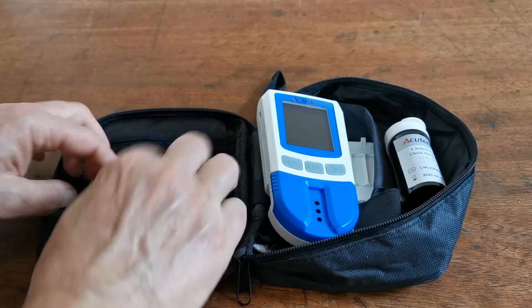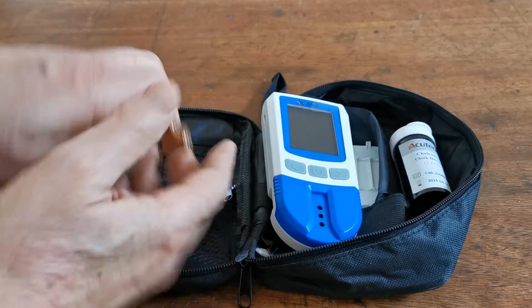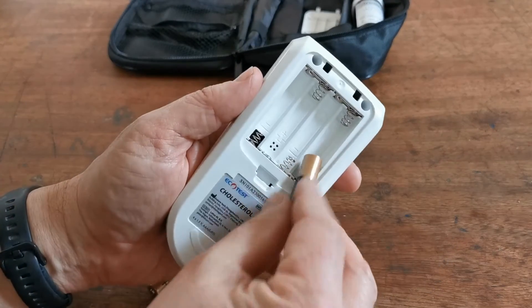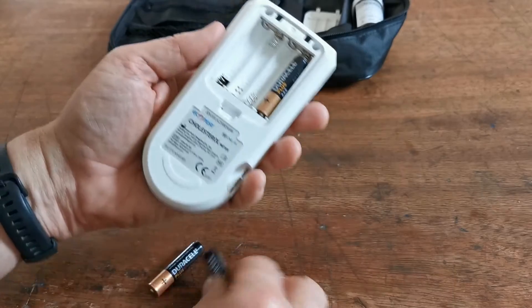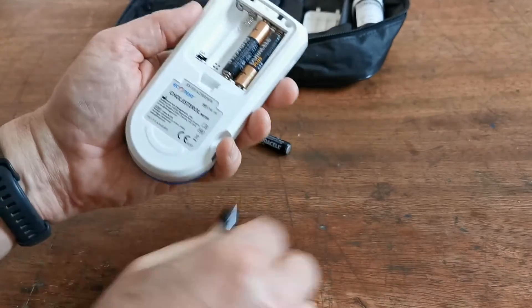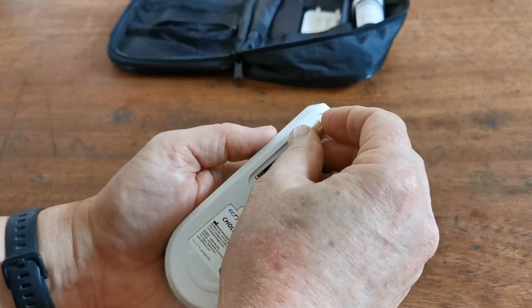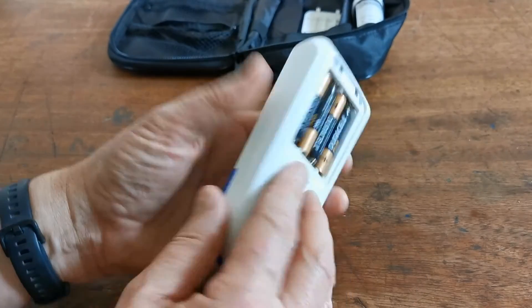Let's put the batteries in and show you the setup on this meter. Move the additional kit out of the way and follow the alignment shown in the base of the battery compartment. As you put the final battery in, you should hear the meter beep.